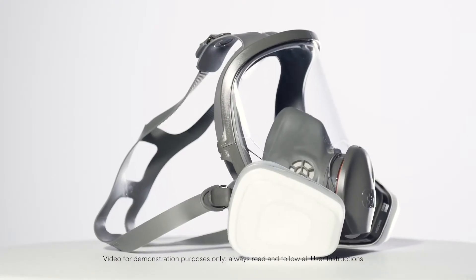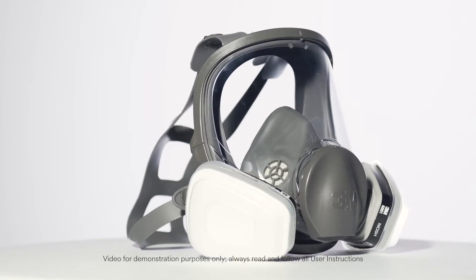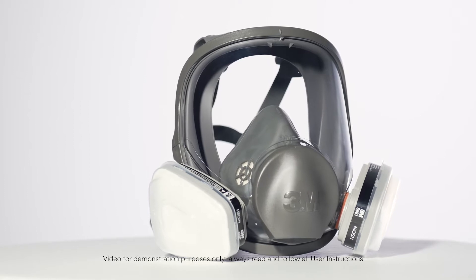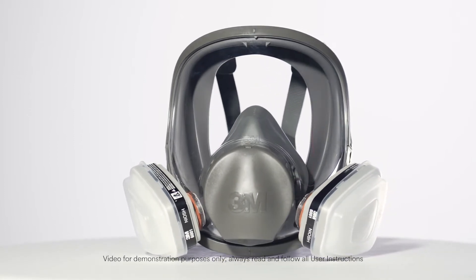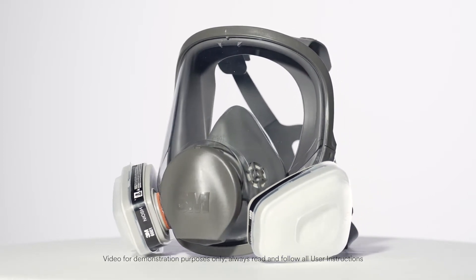To help protect you from certain contaminants in the air where you work, your company has selected a 3M Full Facepiece Respirator 6000 Series for your use on the job. It was chosen by your employer based on the specific types of airborne contaminants and their concentrations in your workplace.